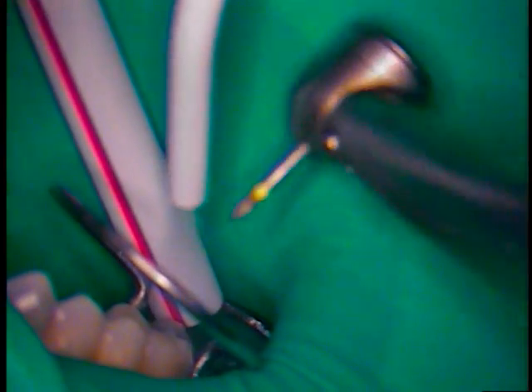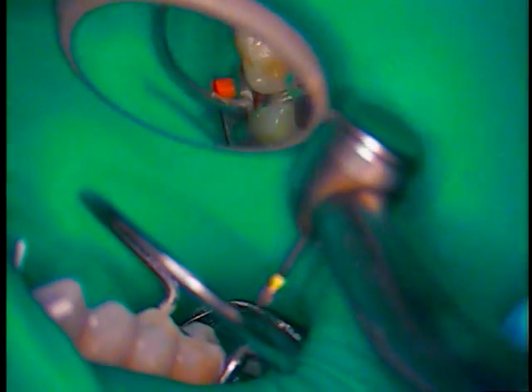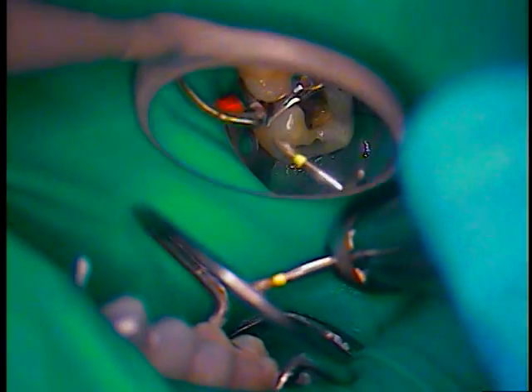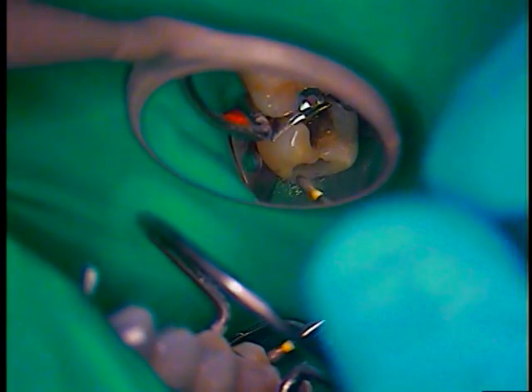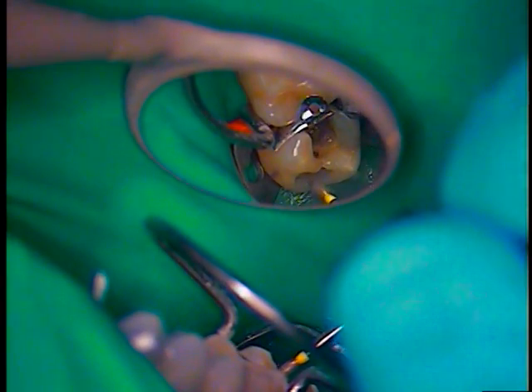And I'm gonna polish. One thing I see, a little something on the back of a margin. Good enough. All right, sliding all the way back, here is something on margin.